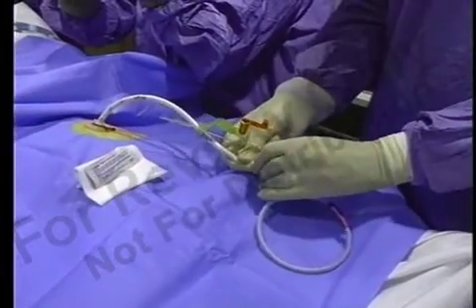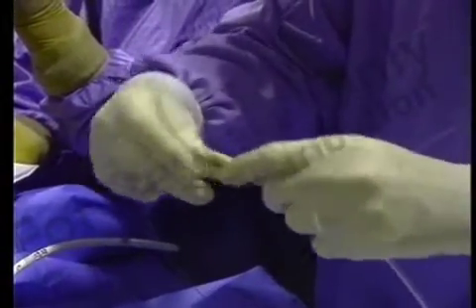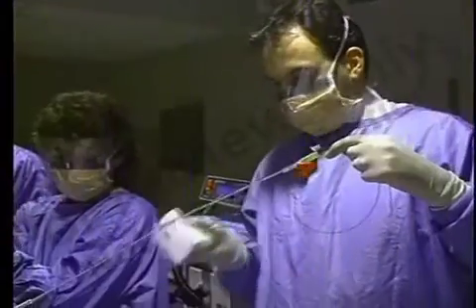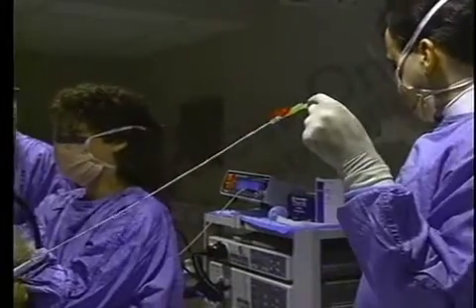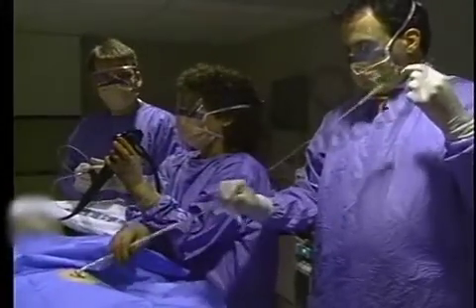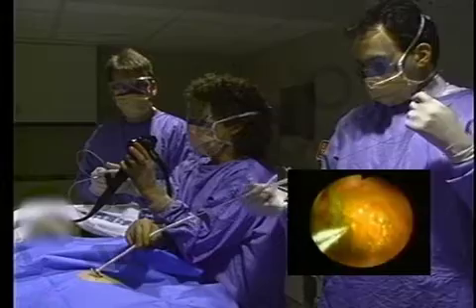Remove the air plug from the G-tube. Place the gastrojejunal tube over the wire guide. Generously lubricate the GJ tube with water-soluble lubricant, especially at the tip. Slowly advance the GJ tube over the wire guide while maintaining slight tension on the wire guide. Continue advancement of the tube until it dislodges the forceps from the wire.